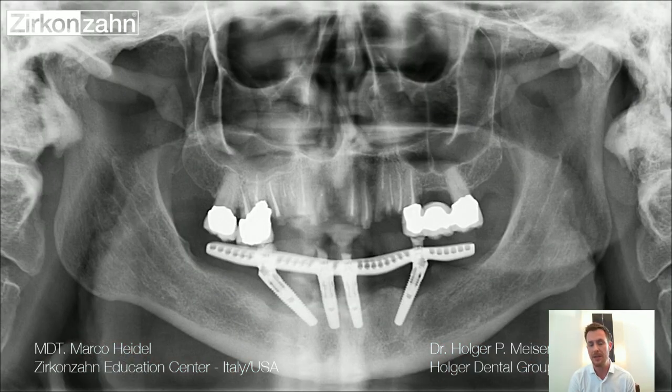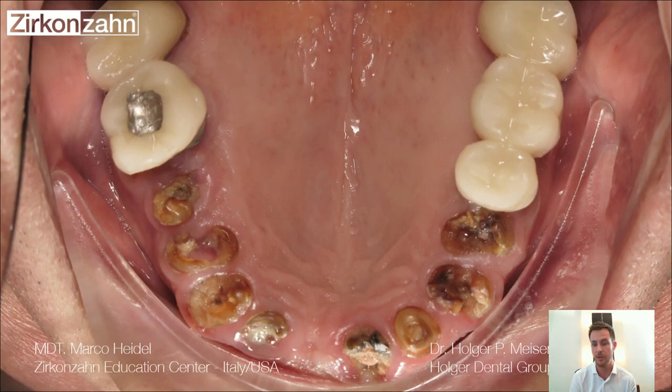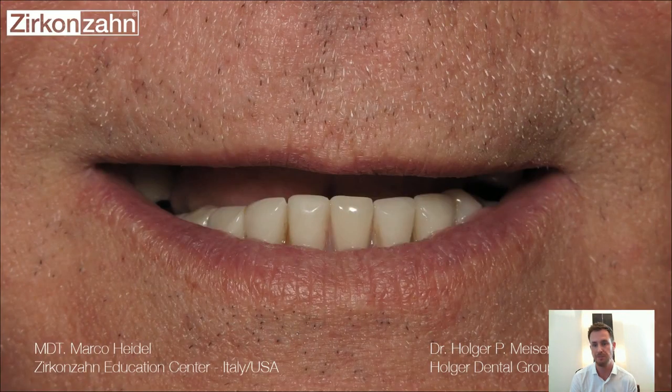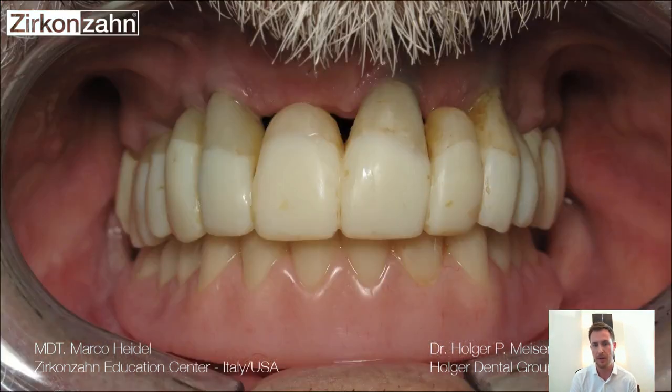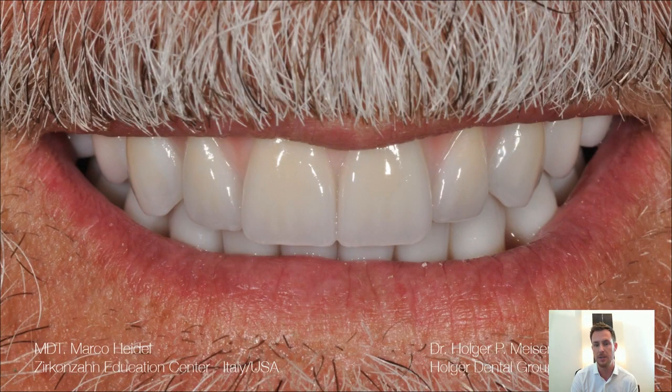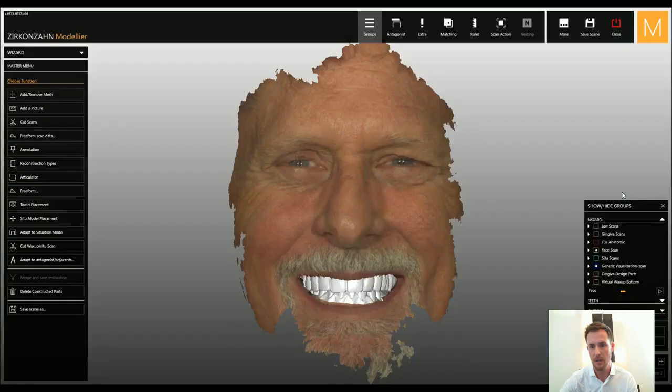Dr. Holger Meiser will explain the whole case beforehand in a short video. It comes right now. As you can see, also very long teeth, and we want to explain to you step by step from this situation until this situation. So enjoy Dr. Holger Meiser now in his video. I hope it does work.